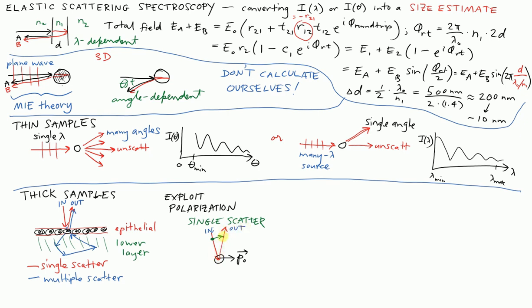And the physics of it is that the outgoing beam is also going to be polarized in the plane of the page. So basically the same polarization as what went in, if you think of it as a true 180 degree backscatter. So it maintains the polarization.